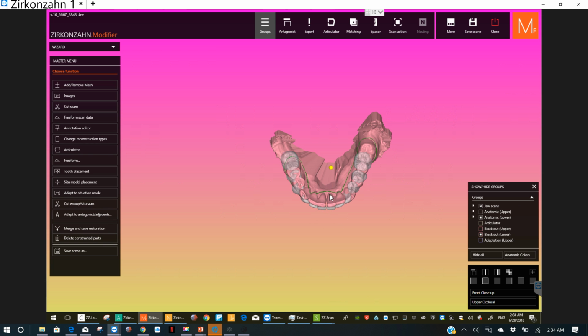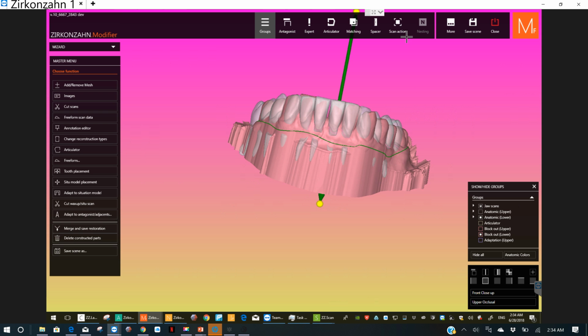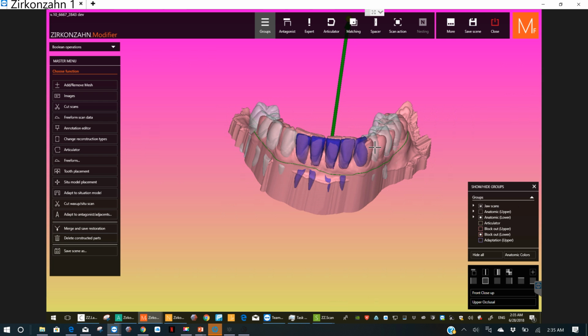Well, that's it. You could possibly do a Boolean action and try to combine those, and then at least do a wax up of it. So, scan action. Select teeth.